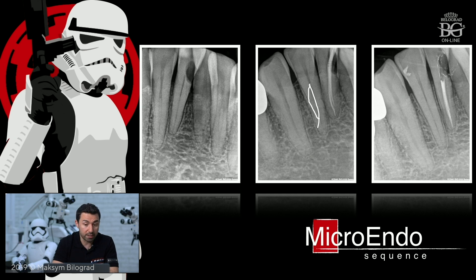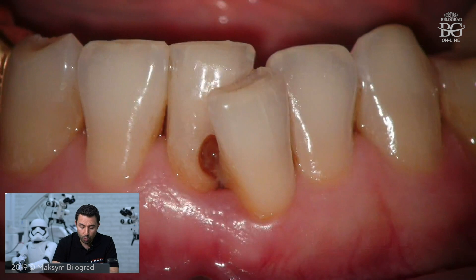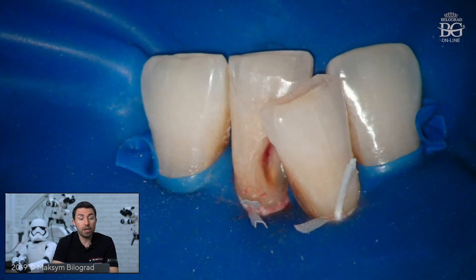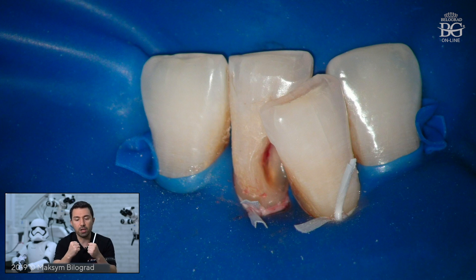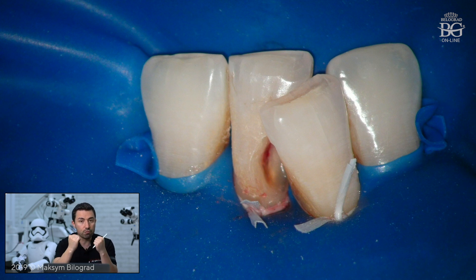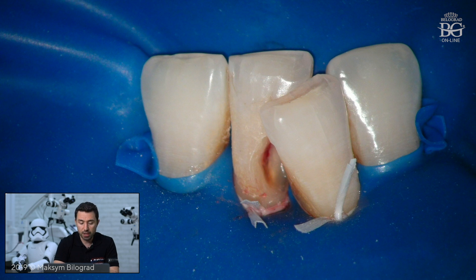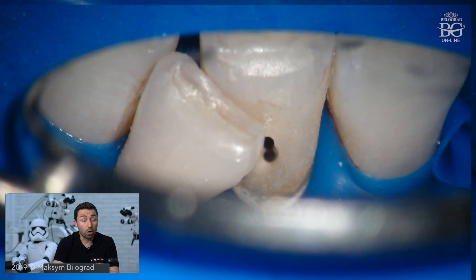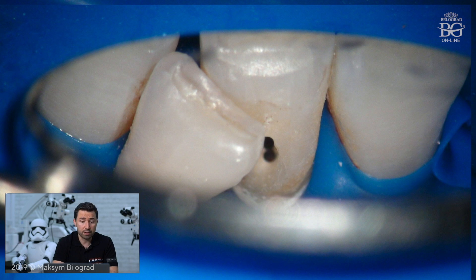We were able to instrument these root canals, perform proper irrigation, and obturate them completely. Now let's move to the restorative and rubber dam part. Rubber dam isolation was achieved using a heavy rubber dam membrane. The heavy rubber dam is really good because it gives strong retraction of soft tissues. I also used a floss tie to move the rubber dam piece more apically, to expose healthy tooth structure. Once caries was removed, we got this defect-oriented access and were able to find the two root canals.